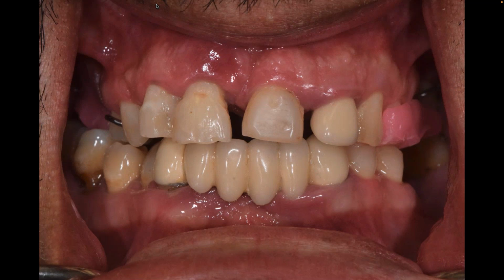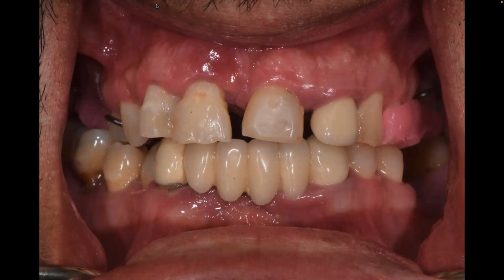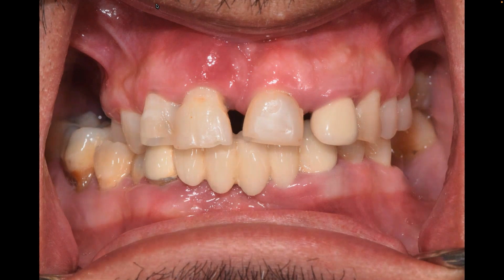All right, so I'm going to do this again. I'm going to go back to MIP and look at the shift to the patient's right. That's MIP. That's CR. That's MIP. That's CR.